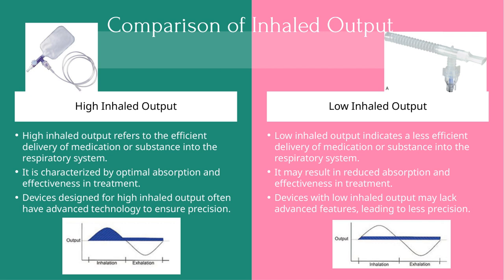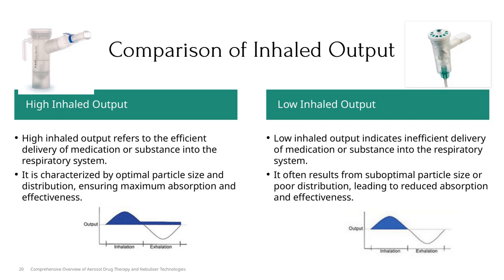When we compare these two, the key takeaway is that high inhaled output generally translates to more effective therapy, thanks to better delivery and absorption. Understanding this difference helps us select the right device for each patient's needs and ensures we maximize the benefits of aerosol drug therapy. Let's talk about high inhaled output first.